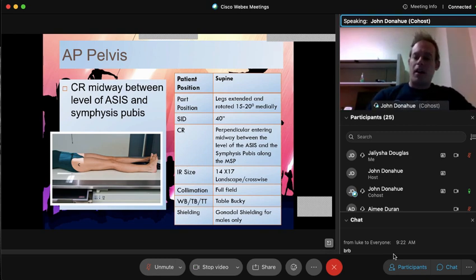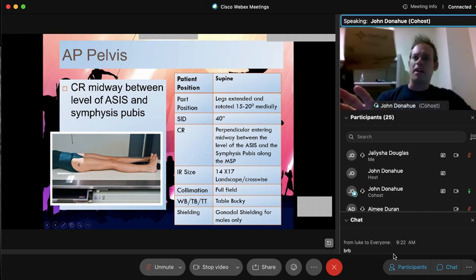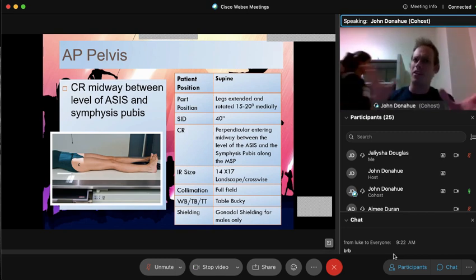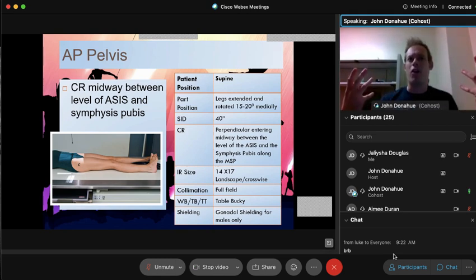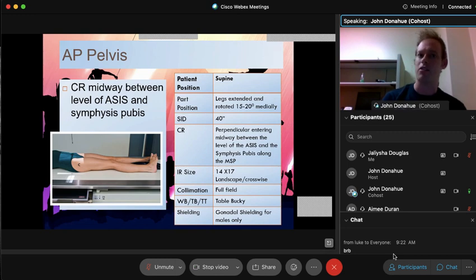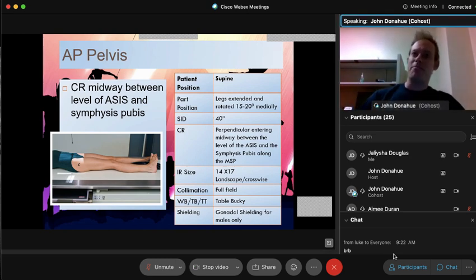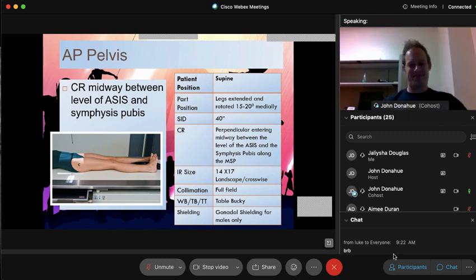All right, so did that make sense, guys? Because that really is a great strategy for those pelvis x-rays. Because I can tell you the method between ASIS and symphysis pubis can be quite difficult. It's even difficult for me because it's really easy to mix up ASIS and iliac crest, especially when you're in a hurry, less thinking overall. You just put that light right above the crest. You'll get that centering right on the money every single time. And that's what my seniors would call the drip method. Lots of drip methods coming, don't worry.